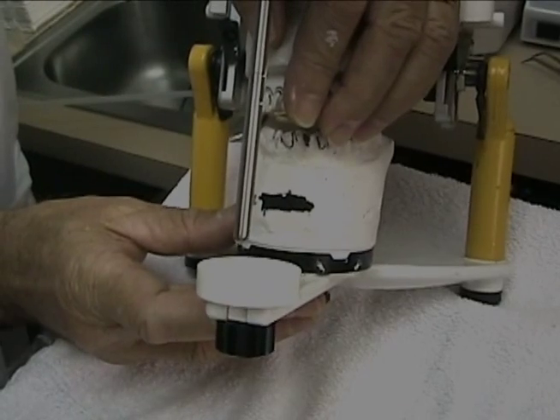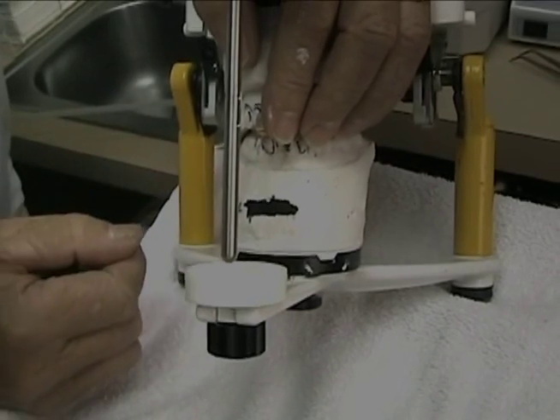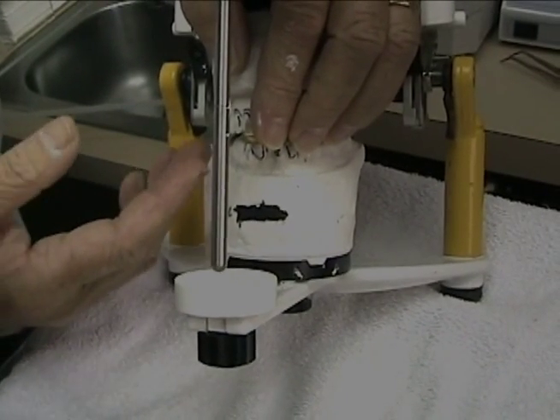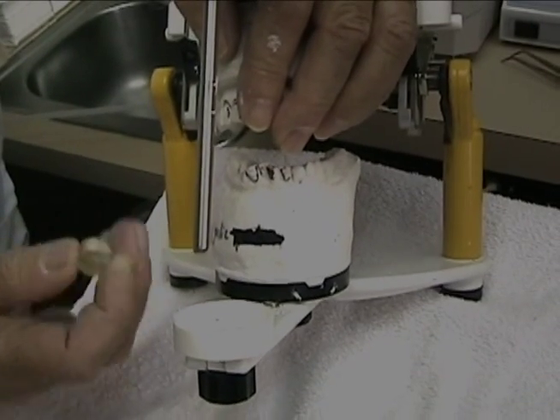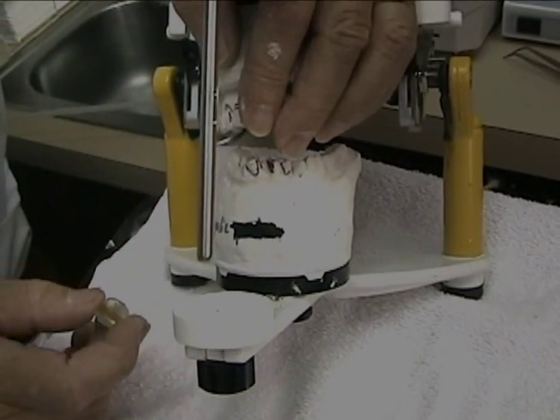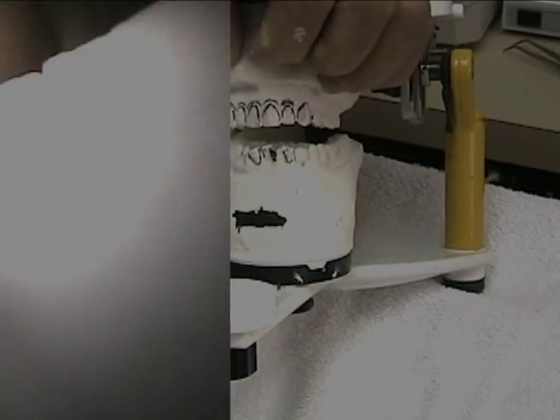We'll then have her touch down on one point, move forward and back to deprogram the muscles. We will then remove this before she touches the teeth again, put articulating paper in, find first points of contact, and essentially do a gross equilibration.